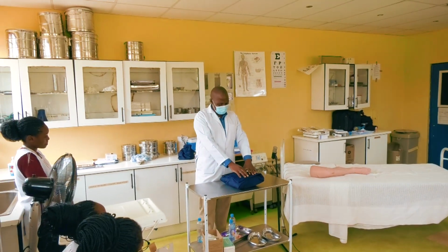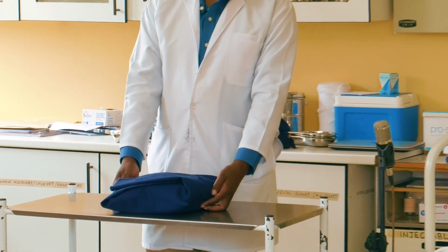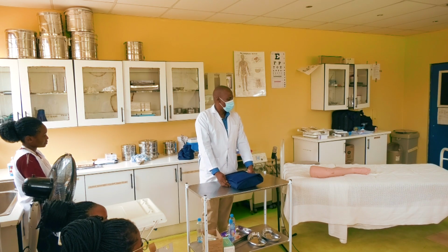Please ensure you check the tape, ensure that this is sterile. For how long do we keep sterile equipment, a dressing pack? For how long can we keep it for us to say this is still sterile?